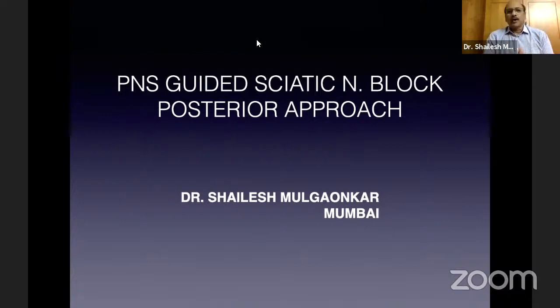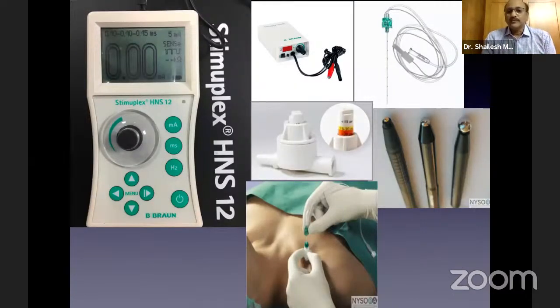Now I'm going to talk about PNS-guided nerve blocks. So now everybody is using a nerve stimulator, but because this is a very deep block, if you have the newer versions of the nerve stimulator or even the newer versions of needles and all, it is much easier to give a block properly. And it saves a lot of time.